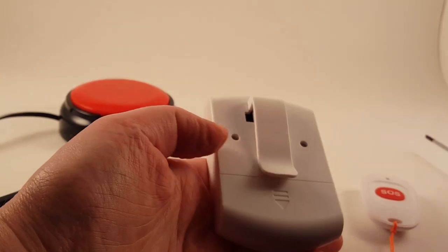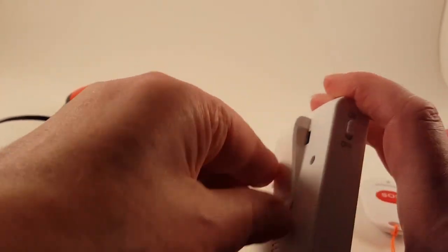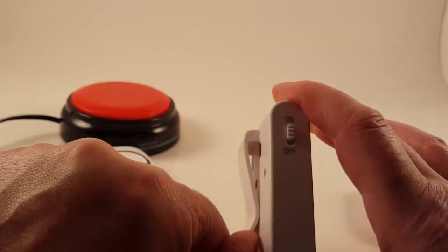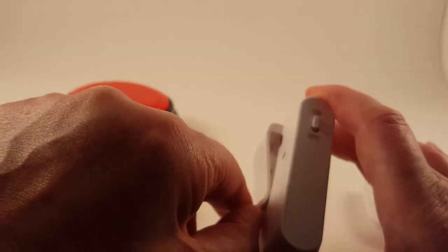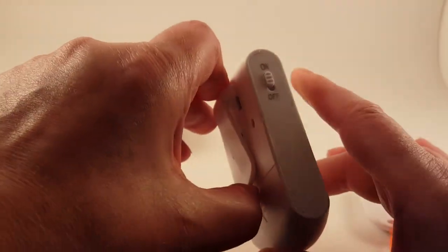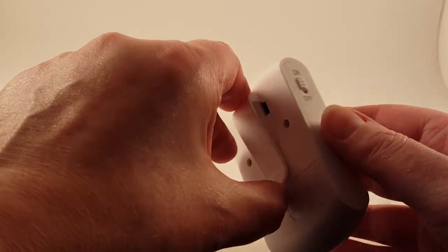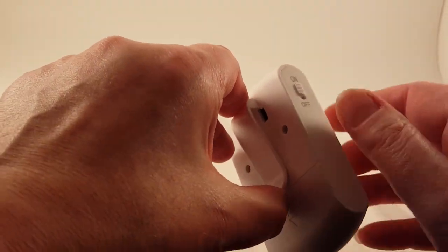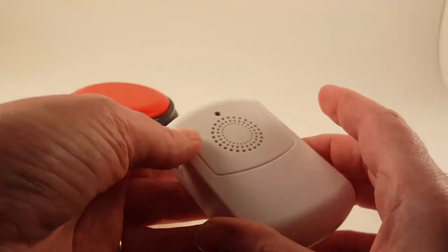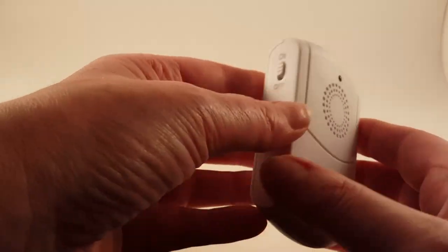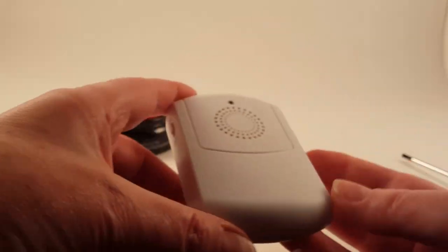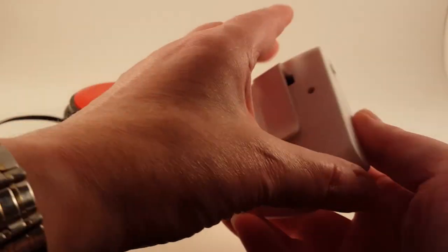On the back of this, you've got a built-in clip that's great to put on your pocket or your clothing or a belt or the edge of your pants or whatever so that you can carry this around with you. You can take this outside with you if you need to, go into the shop, that sort of stuff.